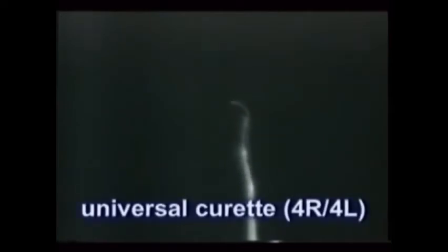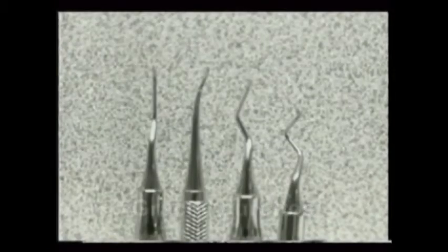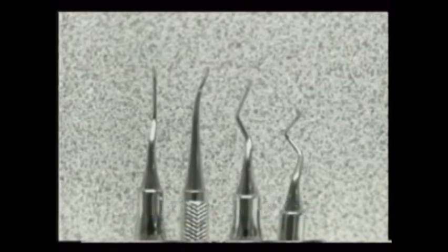Some curettes are also universal in use, with cupped edges on both sides of their blade. This 4R, 4L is an example, and can be used throughout the mouth. Other scalers are designed with an edge on only one side of the blade that allows access only from particular angles, as demonstrated here with the two-sided Gracie curettes for front teeth, bicuspids, and molars. One end treats the right side, the other the left. Adequate instrumentation of the entire mouth requires this assortment of curettes.